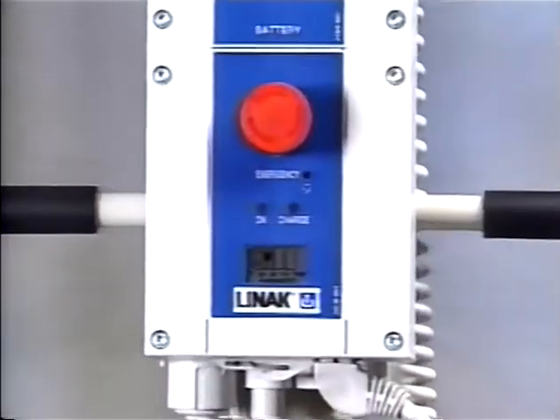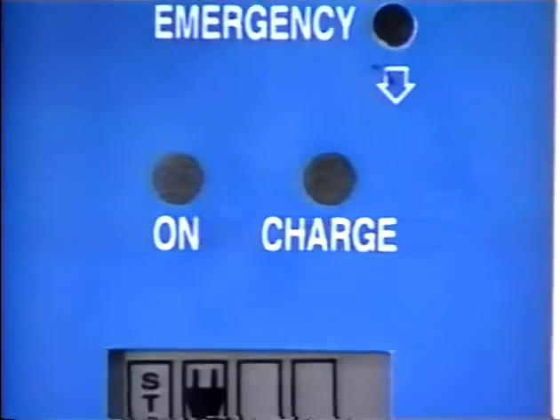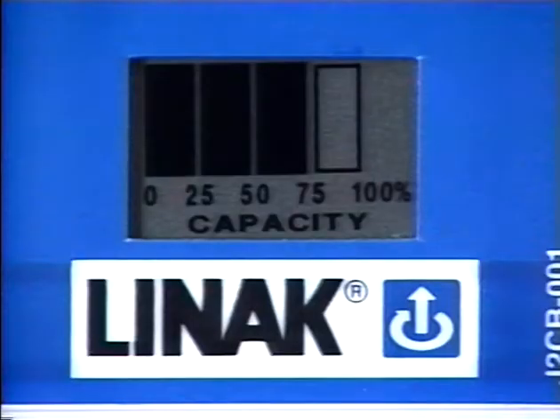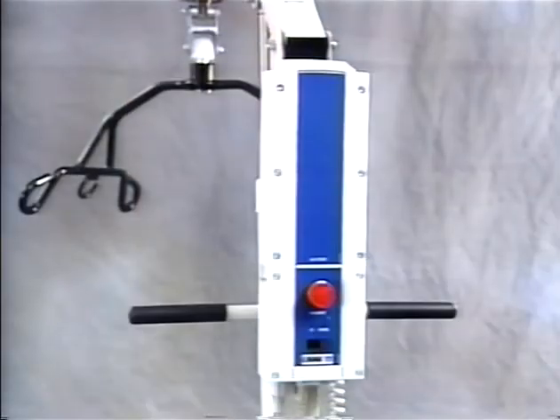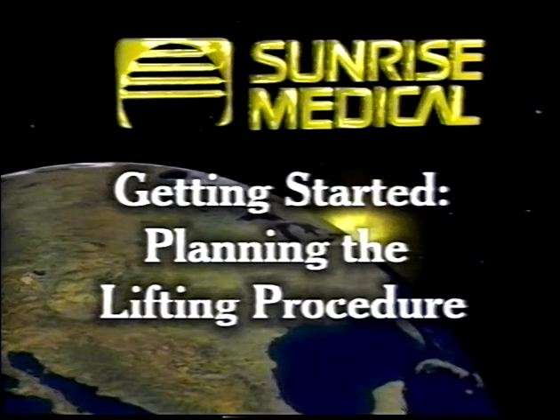The amber charge light will come on during the charging cycle, and it will go out when the battery is fully charged. Full battery capacity usually takes about 6 hours. Because this is a gel cell battery, you can't overcharge it. Just plug it in any time and leave it plugged in without risk of battery memory. Now that you're familiar with the key components, let's move on to the basics of lifting.